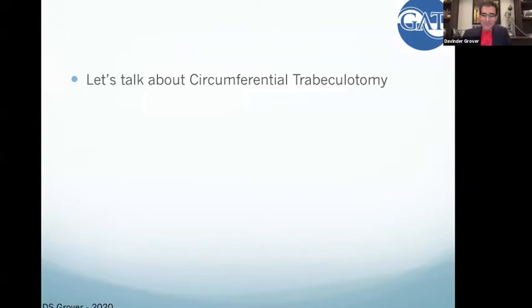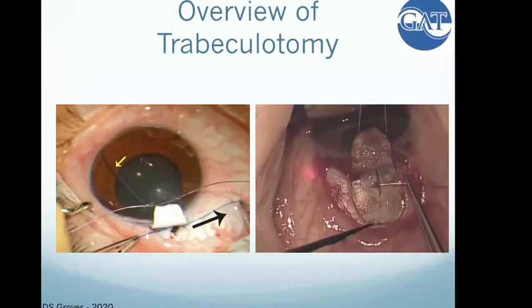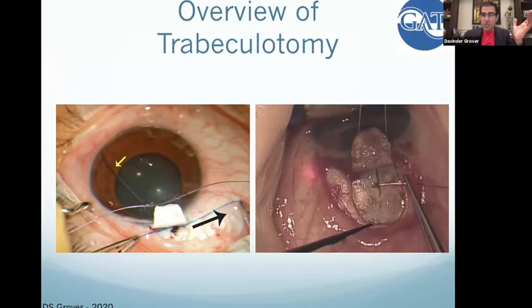Okay, now let's talk about GATT, or circumferential trabeculotomy. Trabeculotomy is an old-fashioned surgery and it's been around for a while. Traditionally it was done using a conjunctival flap and a conjunctival dissection to find Schlemm's canal externally. And it took a lot of time.